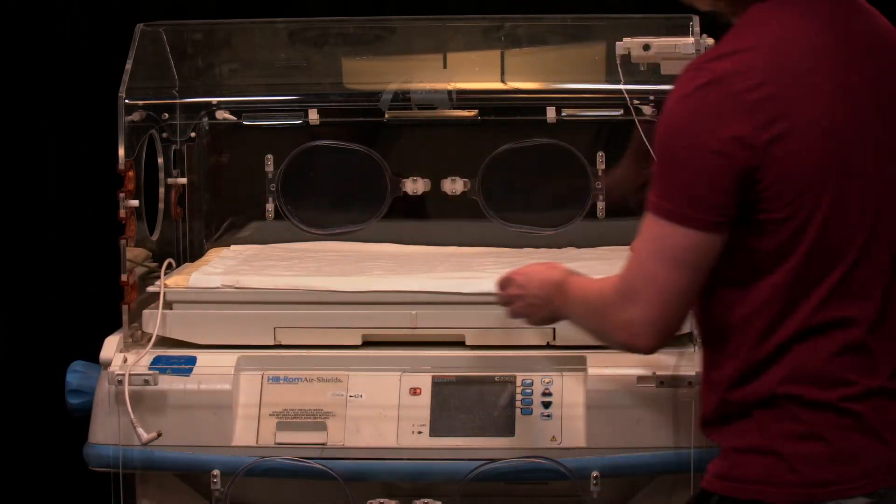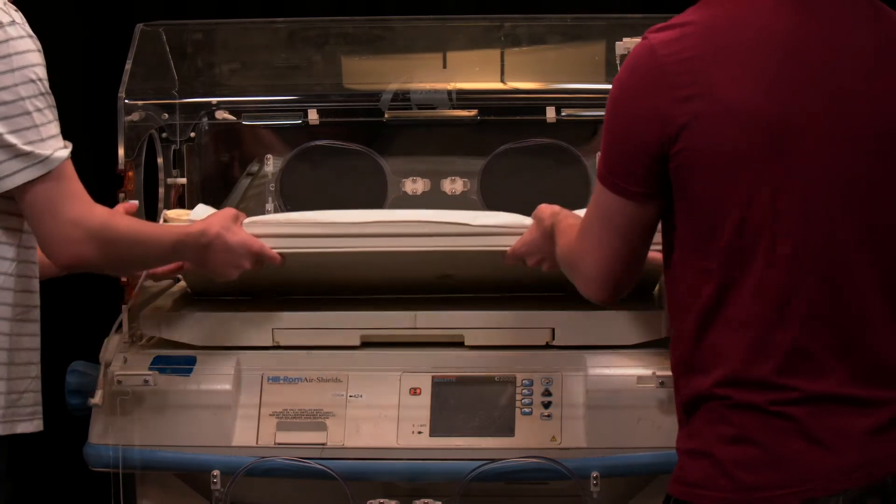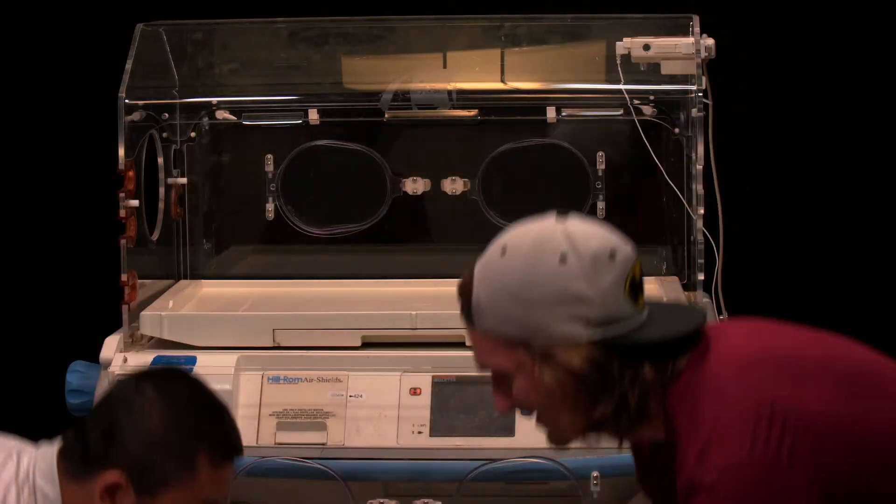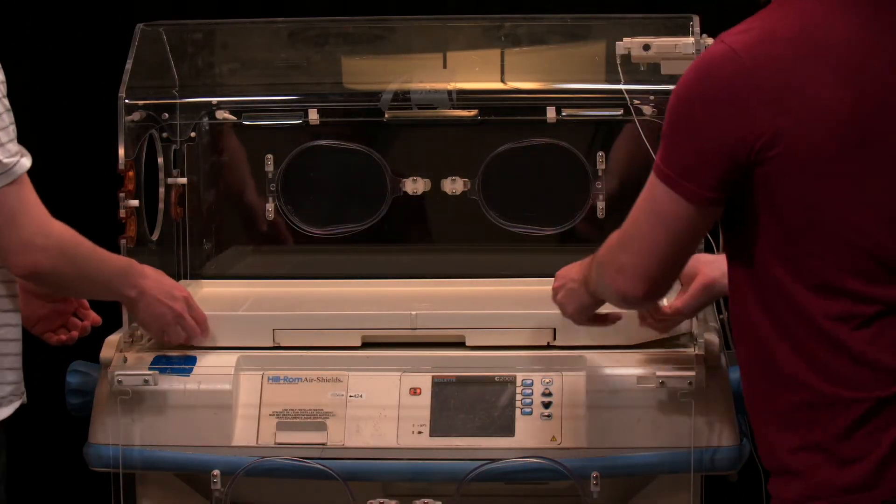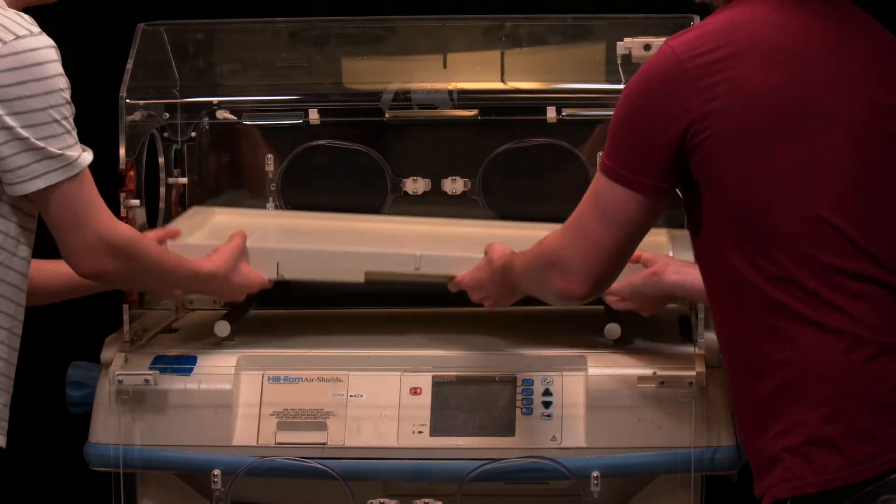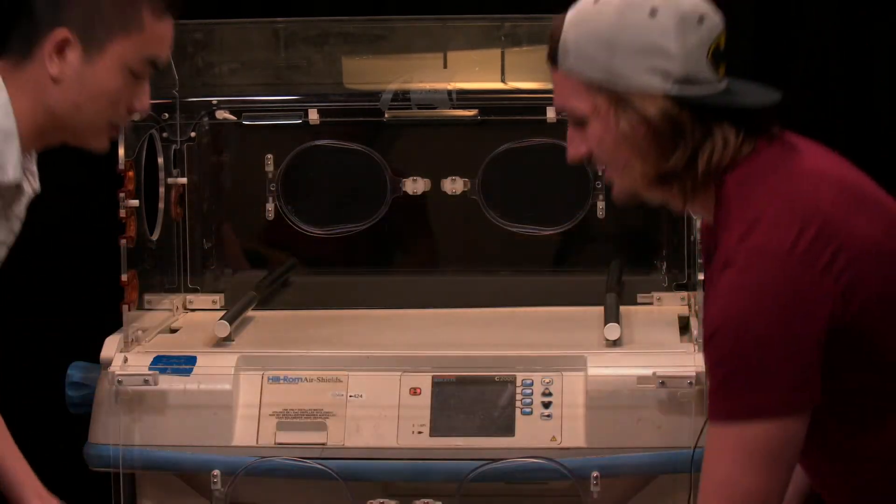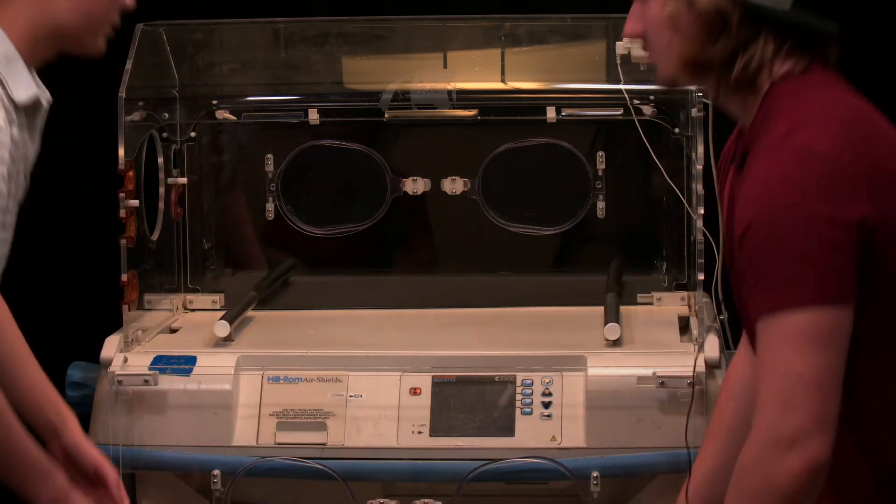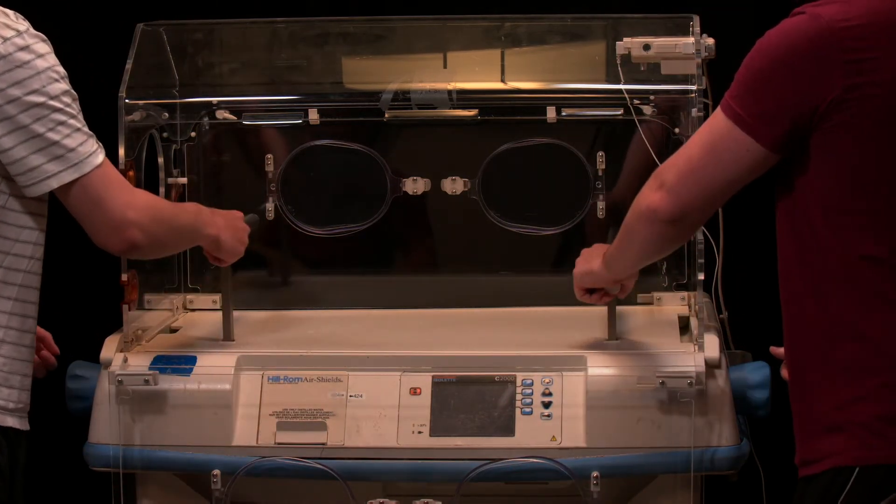Next, you've got to take out the infant bed. Next, you've got to take out the rails and you can just pull those out.